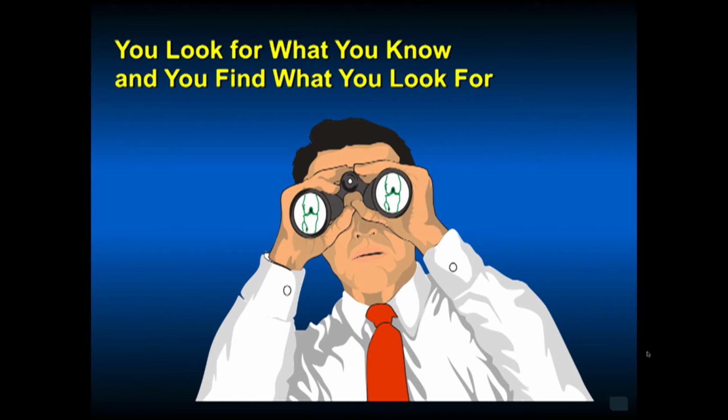In my opinion, I would seek consultation from those who you trust, and a good orthopedic consultation is better than a lot of advanced imaging that may not give a diagnosis. Seek earlier consultations rather than getting more radiographic tests. If your orthopedist wants every imaging test done prior to seeing the patient, I would suggest having another orthopedist as your consultant for that particular patient.